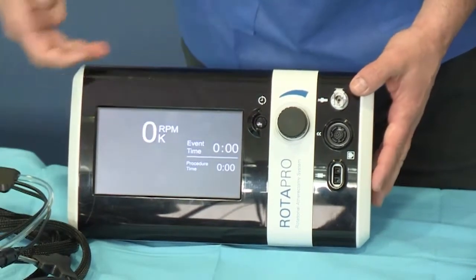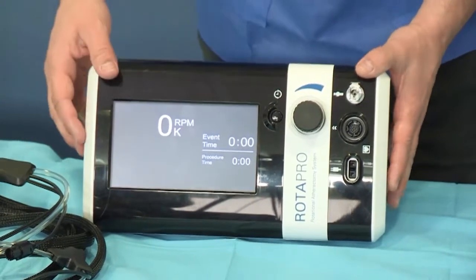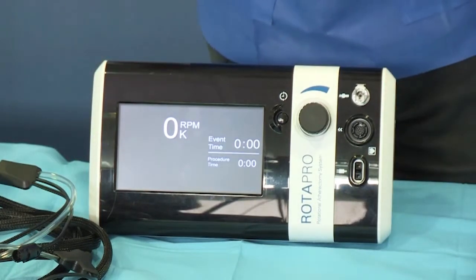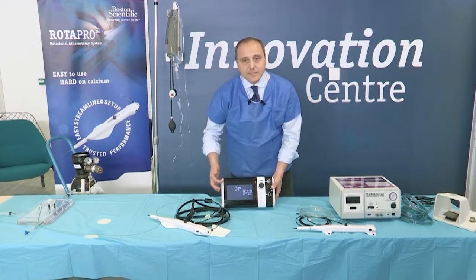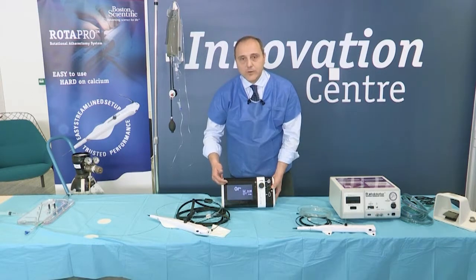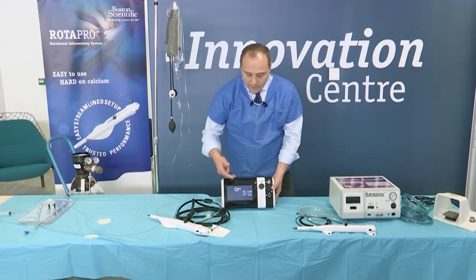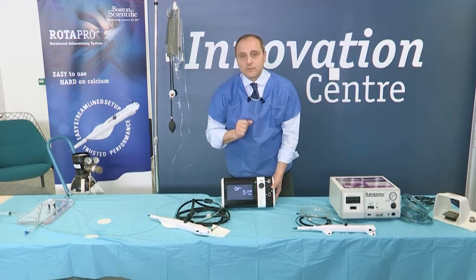The console is much nicer, and it is much easier to read. There is a lot of information on the console that we will see in a minute when we move to the model. But I can immediately tell you that this information will inform the operator on the current rotablation speed, whether we are in Dynaglide mode or in rotablator mode, the duration of each run of rotational atherectomy, and the total duration of the procedure.